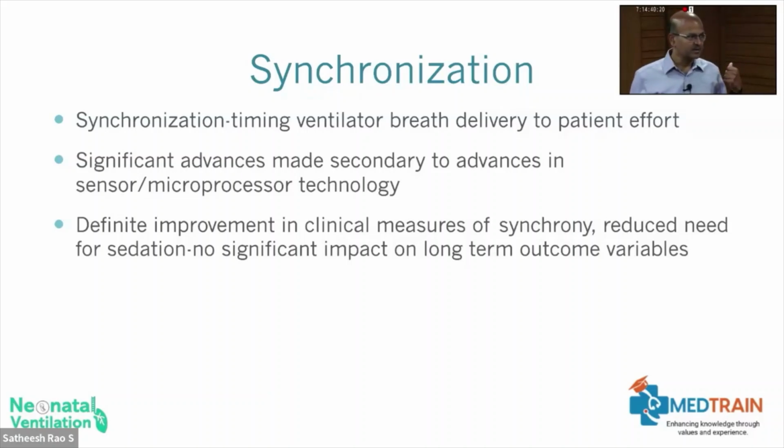Even though we have evidence for volume guarantee, for synchronization itself the research evidence is not strong because it's multi-parameter that affects. It shows that it helps a baby, the comfort level is better, but the outcome like BPD is not shown to be beneficial. But that's difficult to assess in a research setting. Multiple factors impact on it. So not using sedation itself is enough reason to synchronize.